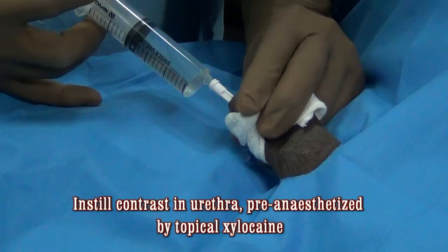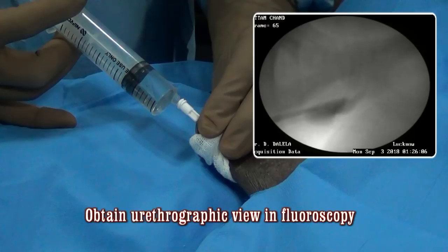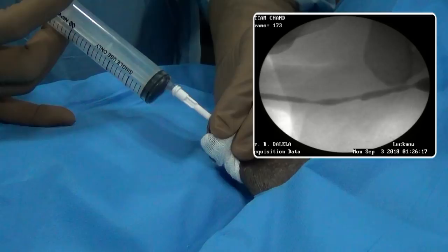As you can see here, the instilled contrast is filling up and distending the urethra, and you can see contrast going into the bladder lumen — you can actually see the entire urethra. You must observe the distensibility of the urethra: in a normal segment the urethra will distend, whereas in a diseased or strictured segment it may not. So obtain a complete idea of the entire urethra here.